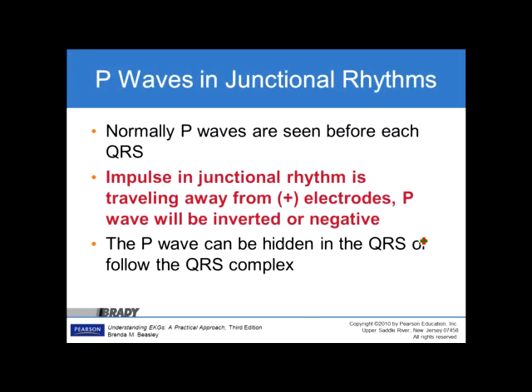Regarding P waves in junctional rhythms: normal P waves are seen before each QRS in sinus rhythm. With junctional rhythms, the impulse travels away from the positive electrodes, so P waves will be inverted or negative. P waves can also be hidden within the QRS or appear following the QRS.